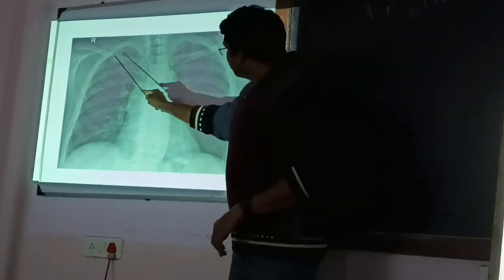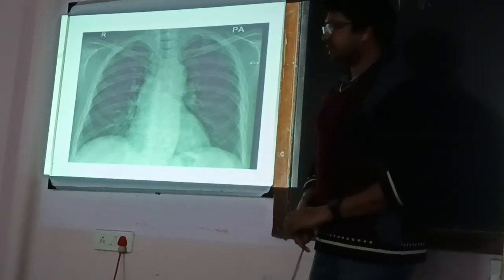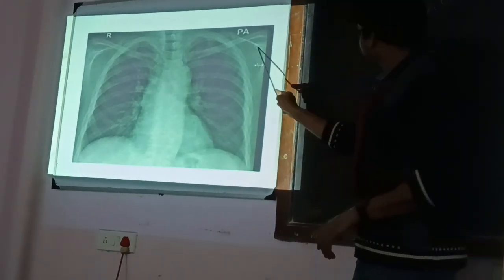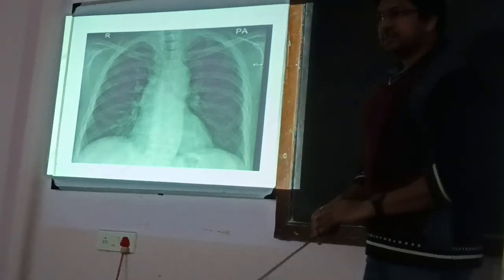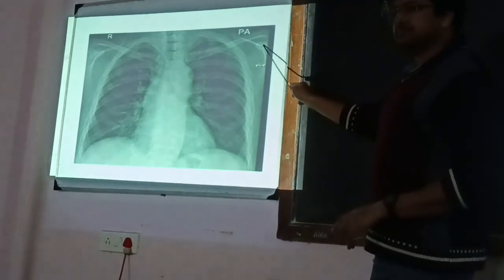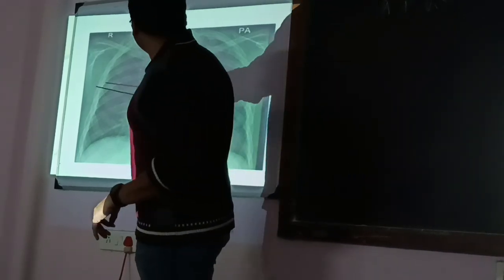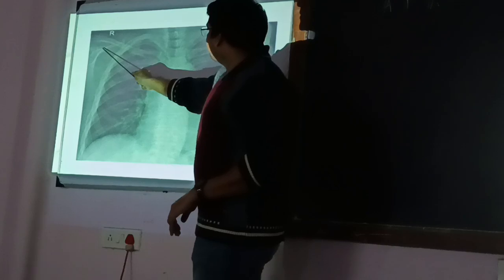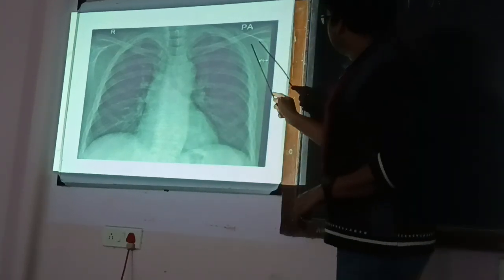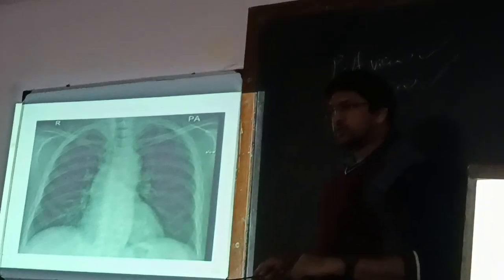You can appreciate the scapula over here, the scapular image. Could you able to see that? This is also the scapula. And this is the coracoid process. Okay, this is the coracoid process over here. We have already seen this in the superior extremity.